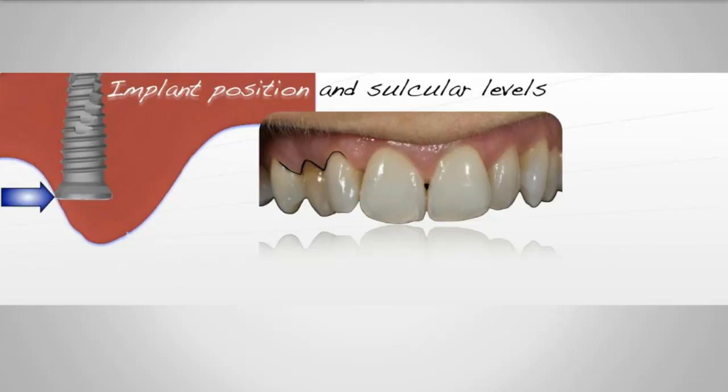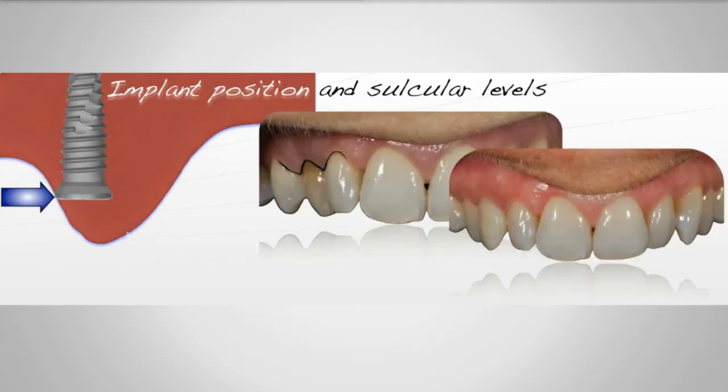So in this case, we are developing the soft tissue. We're dramatically changing it. Here it is after a few weeks of healing. So you can see the contours of my provisional are very similar to that of the natural tooth over here. And even pushing that implant considerably to the facial aspect, we have nice buccal contours. It's moved apically. We almost move a little more apically to completely idealize it. But you understand the concept. We moved it facially intentionally to develop that soft tissue.